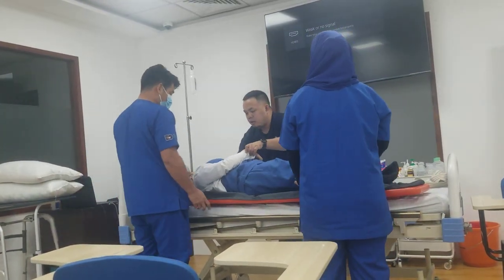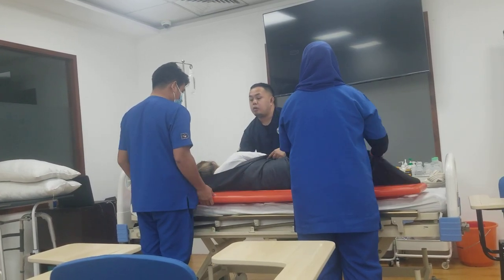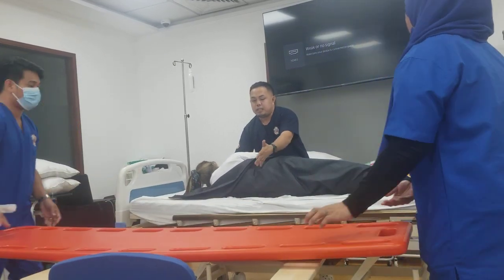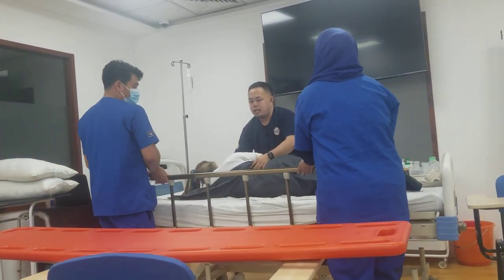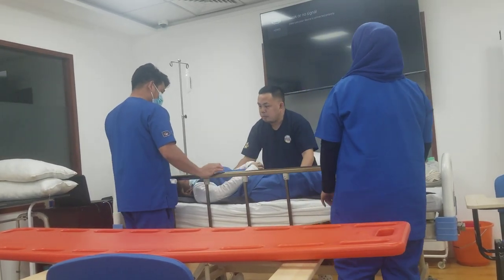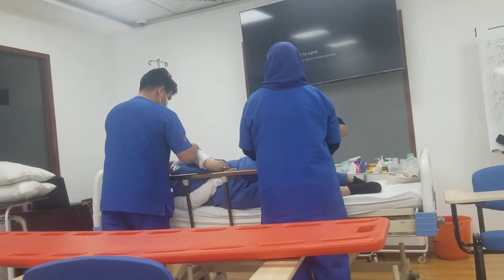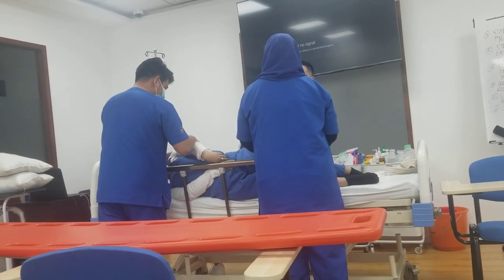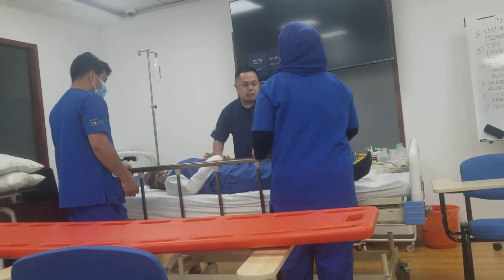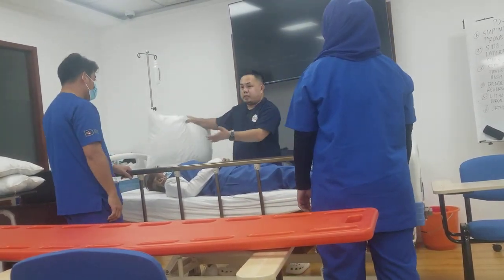Ask the patient: 'Would you mind rolling to the side?' Then remove the board. Put the side rails up, roll the patient towards you, and have your colleague remove the slider sheet. Then roll the patient back to the center.